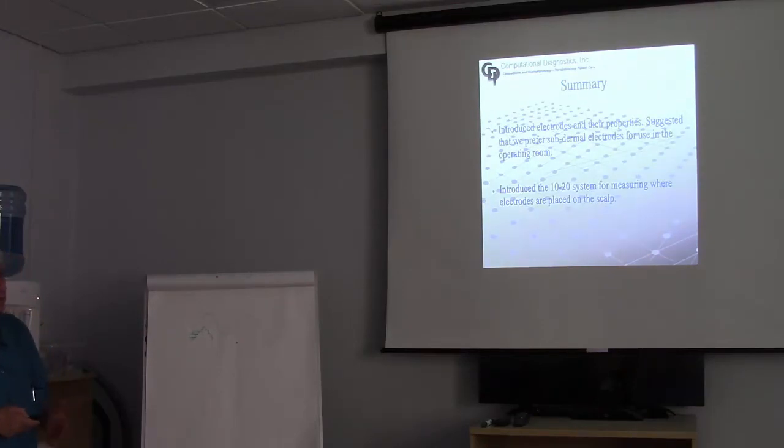So, a very quick run through on this material, which I think everybody has some understanding of. The big difference between the diagnostic lab and the operating room is the needles really work well. You can place them, you can suture them in place, you can re-staple them in place if it's a long operation. They really are not uncomfortable for the patient.